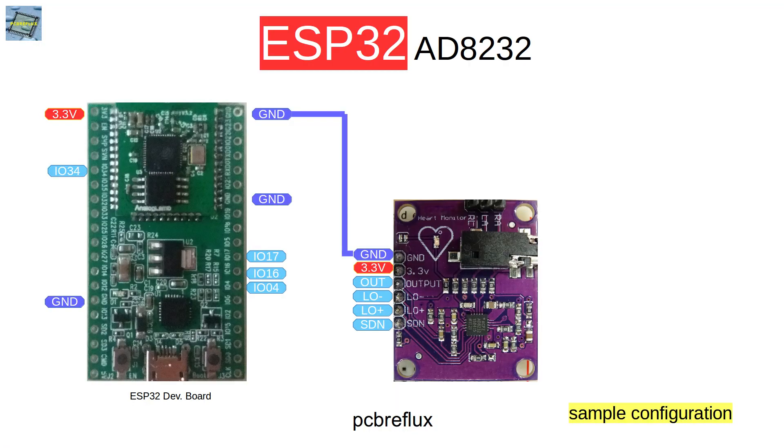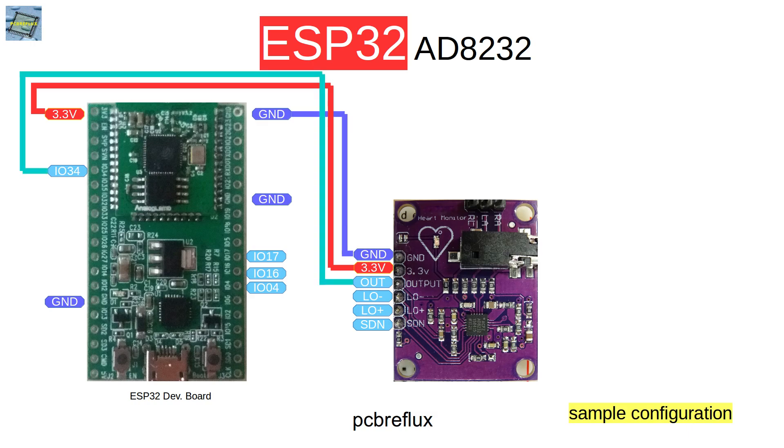First we can have a look at the wiring of the ECG module. It uses 3.3 volt, which fits our ESP32 that also has 3.3 voltage on all outputs and GPIOs, so we can easily use this module. We first tie up the ground to the ground connection, then the 3.3 volt, and we have an output pin which I connect today to GPIO pin 34.